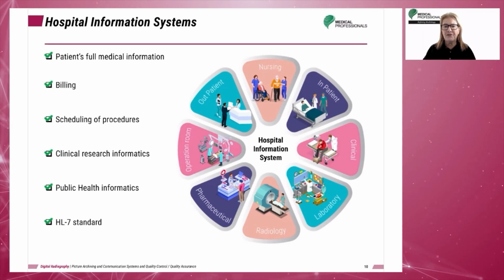In the healthcare system, the HIS communicates with the Radiology Information System, or RIS, and all other computer shared systems within the institution for shared functions. The HL7 software standards were set by the American National Standards Institute.